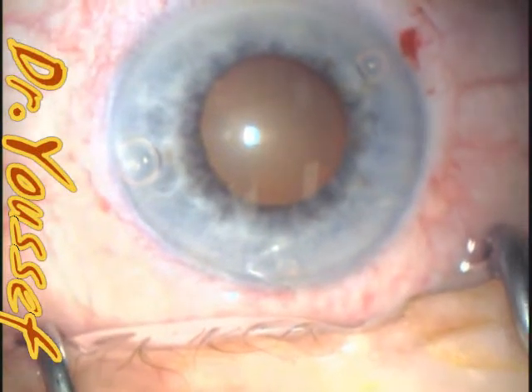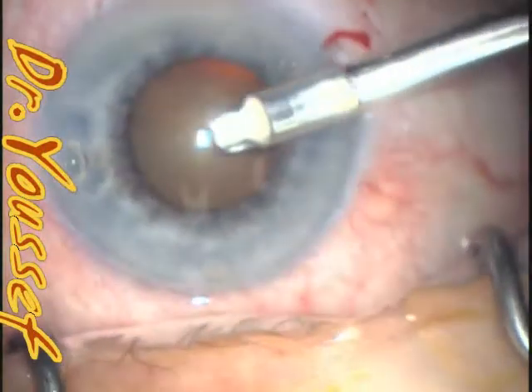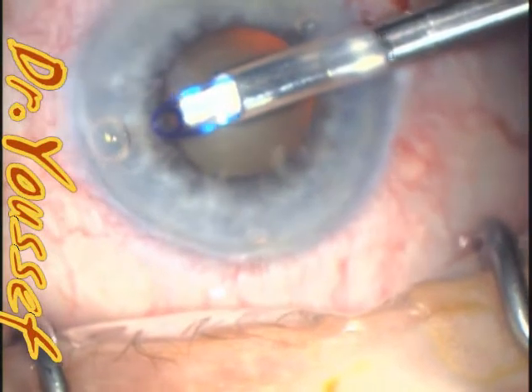Hi, I'm Dr. Youssef. I'm going to be showing you this Malyugan ring case. I skipped the part that's not important. This is the Malyugan being implanted.